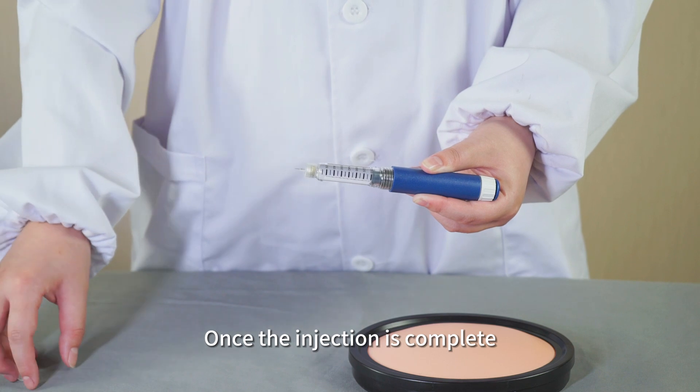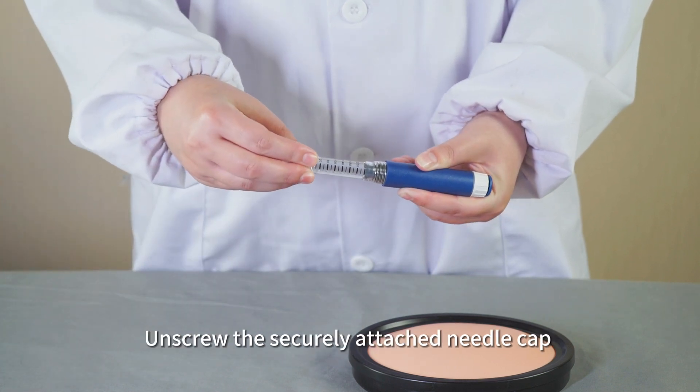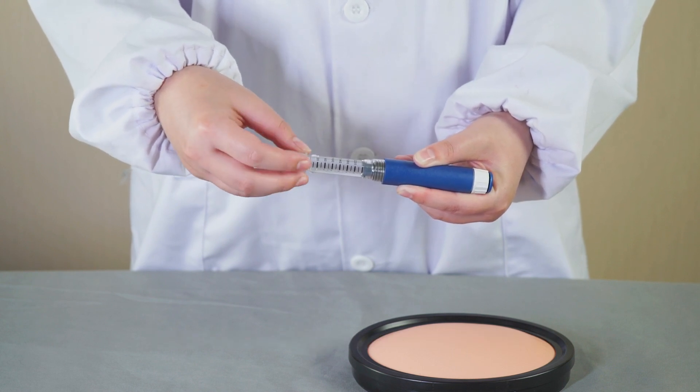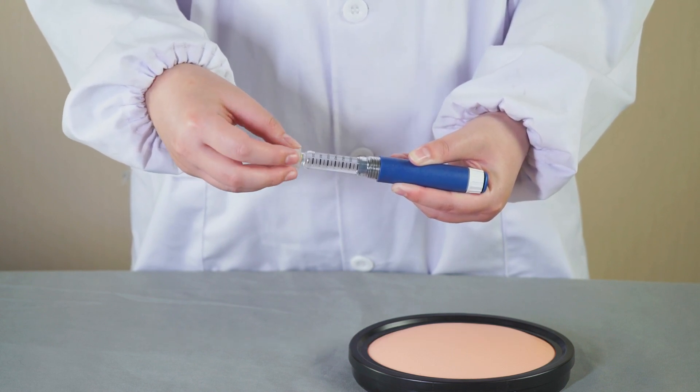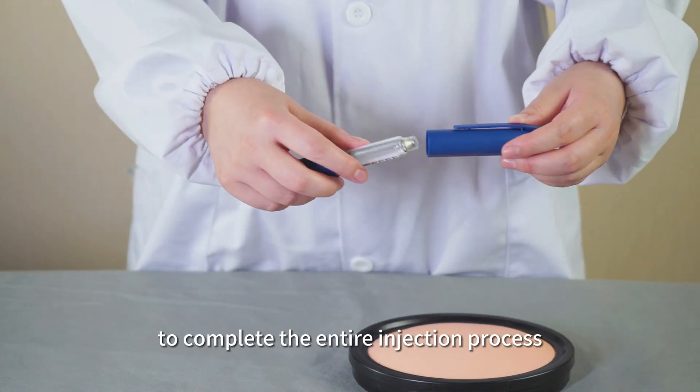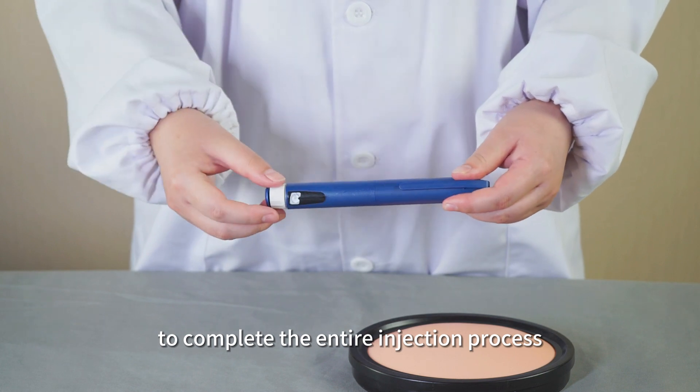Once the injection is complete, cover the needle with the outer needle cap. Unscrew the securely attached needle cap and discard it. Put on the pen cap to complete the entire injection process.